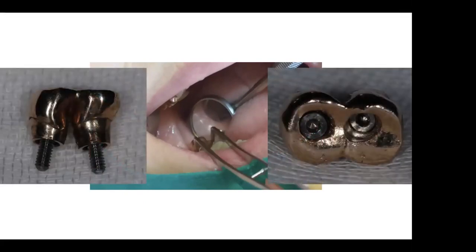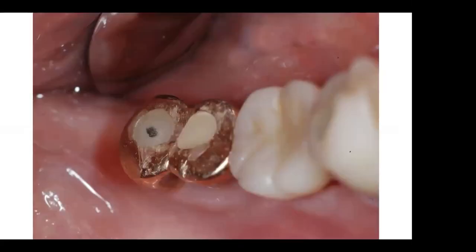So this is what happened. I made two access openings to get to the screw, and I was able to retighten it and then fill the access opening with cotton and resin. So this is what you see afterwards.